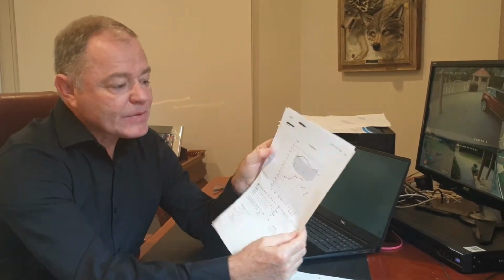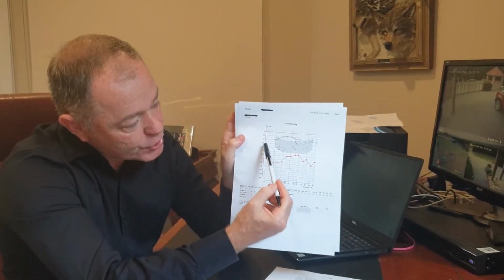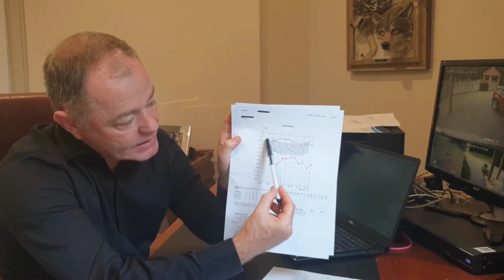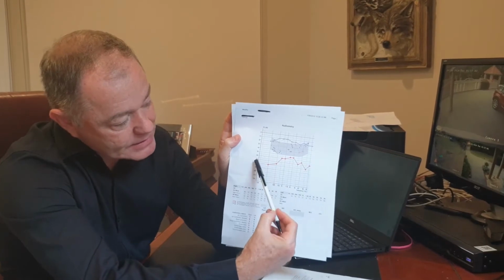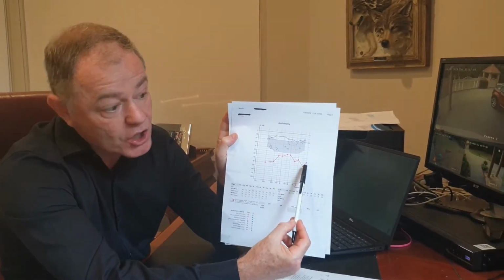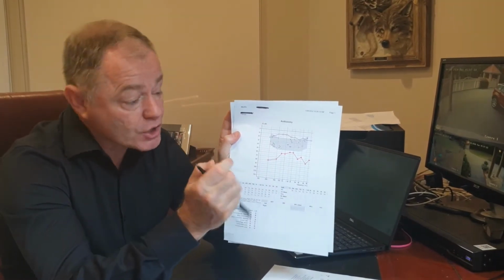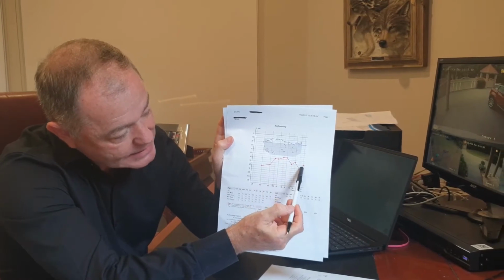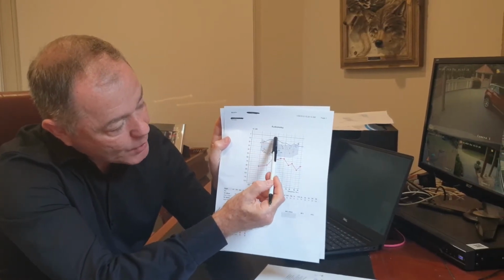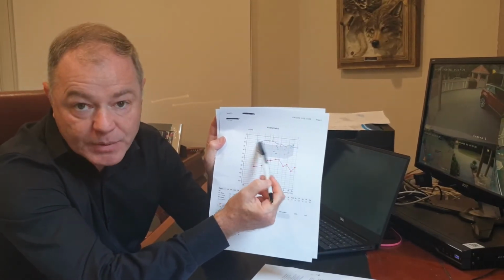Now, the alternative to that is a hearing loss that looks more like this. In this case, if we look at the blue, which is the left ear, it's within a normal range. The right ear, however, that's quite a severe loss. And if we have a look at the bone conduction results of the right ear, instead of it following exactly the same pattern, the right ear bone conduction results are sitting right up here at the top of the page.